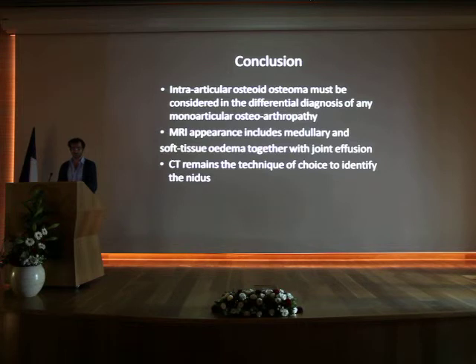So in conclusion, intra-articular osteoid osteomas must be considered in the differential diagnosis of any monoarticular osteoarthropathy, especially in the hip. MRI appearance includes medullary and soft tissue edema together with joint effusion, and CT remains, of course, the technique of choice to identify the nidus.